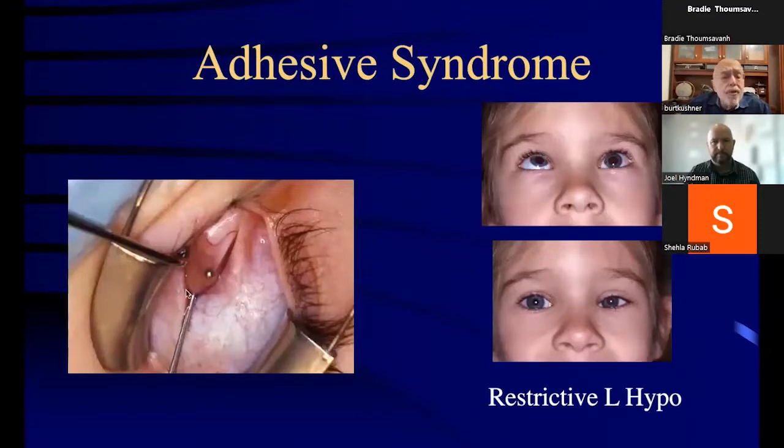When you hook the inferior oblique muscle, it often comes up. This is the edge of the muscle, and then this is fatty connective tissue behind it. And I sort of wriggle the tip of the hook so it's right at that interface between fat and the muscle. And then I cut down on the hook here to make a little buttonhole for the tip to come out.